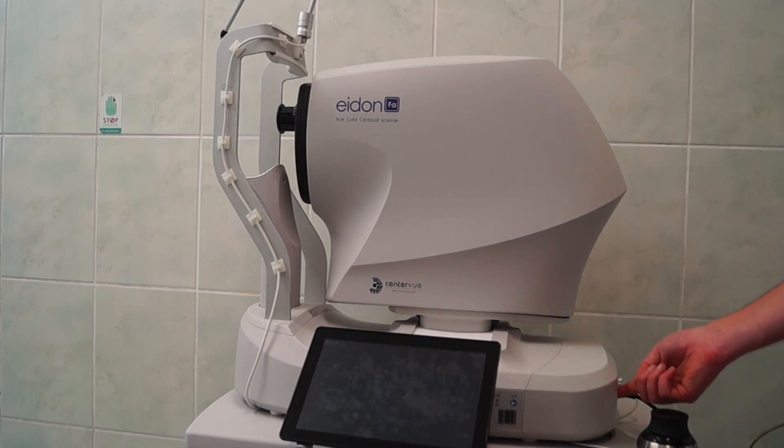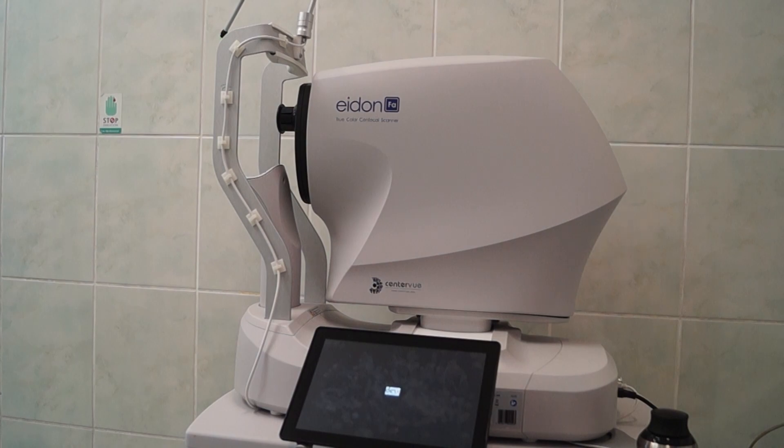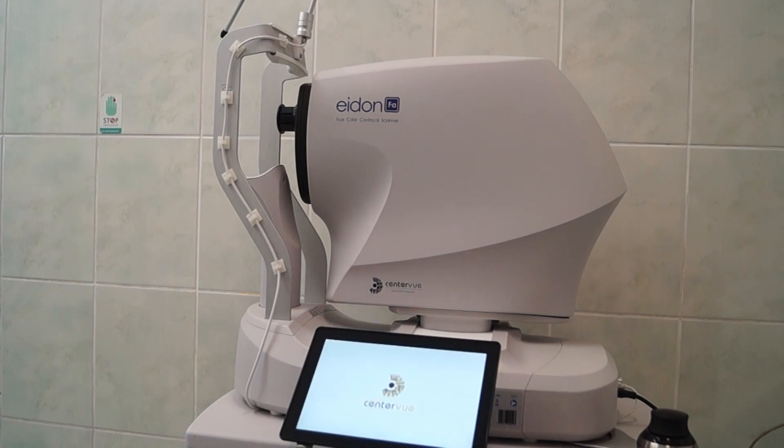Let's start the machine and see how long it takes to turn on. This is a confocal scanning laser ophthalmoscope, which means it's confocal, so you don't see any eyelashes or media opacities. But because it's a scanning laser ophthalmoscope, the images have a distinct appearance since they are basically colored by the software.